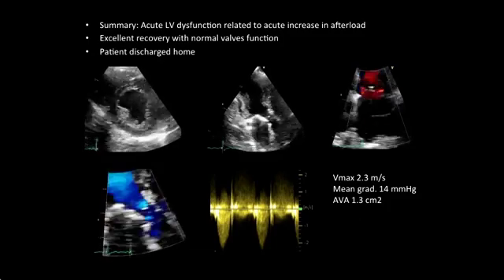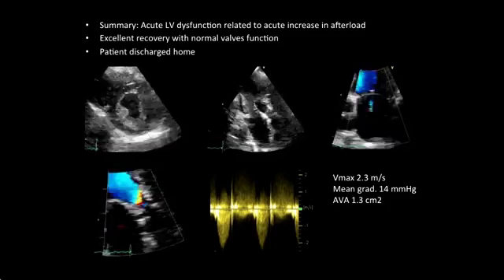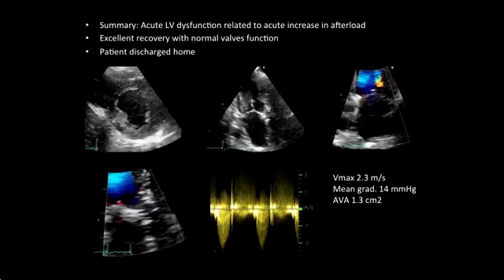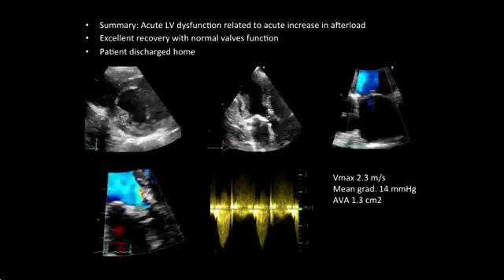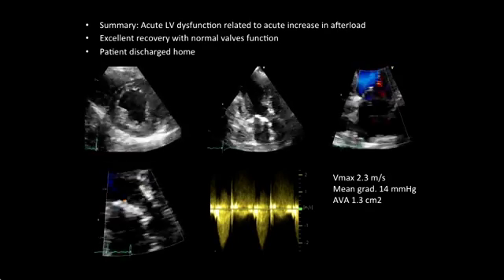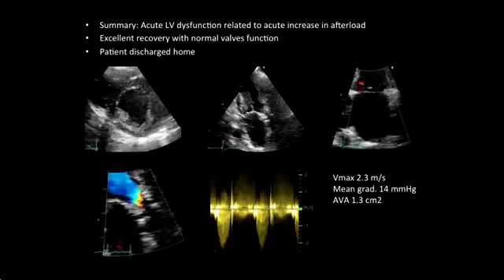The acute left ventricular dysfunction was interpreted as secondary to the acute increase in afterload, when the undeployed prosthesis was placed into the very severely stenosed aortic valve. This dysfunction was completely reversible, as shown on the discharge transthoracic echocardiography.